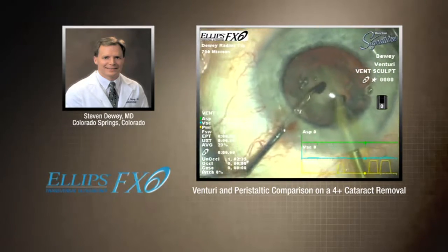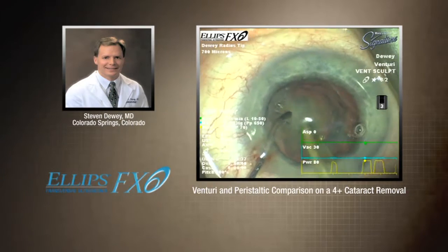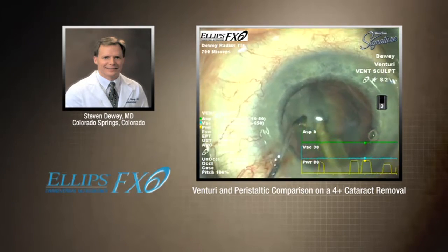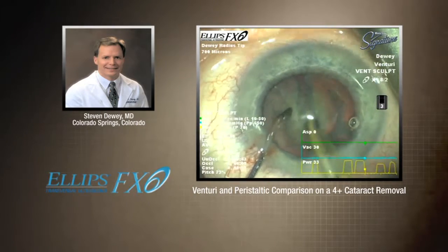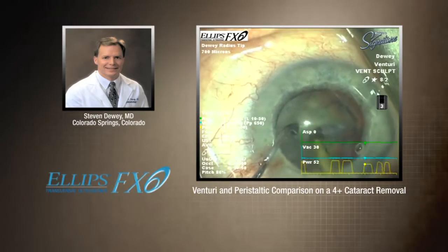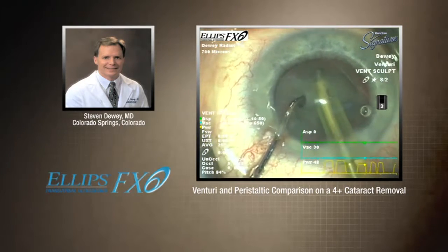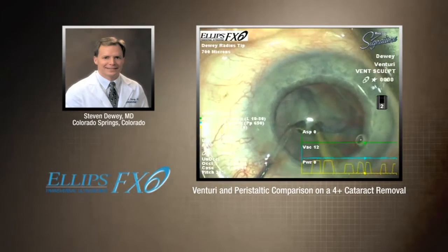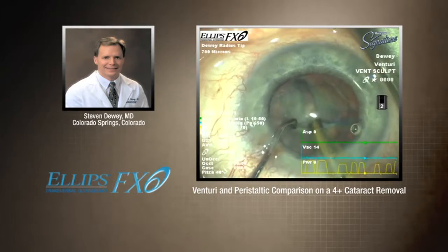I was really pleasantly surprised. Here I am trenching with Ellipse FX with really no difficulty — a little difficulty with my side port there, getting my second instrument in, but that's exactly what Ellipse will do for you. It'll allow you to trench, it'll allow you to sculpt. You can use a straight needle, you can certainly use a 19-gauge needle. Because of fluidic considerations, I wouldn't use it with Venturi.